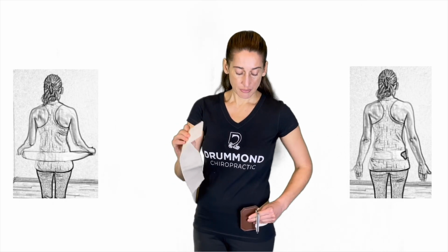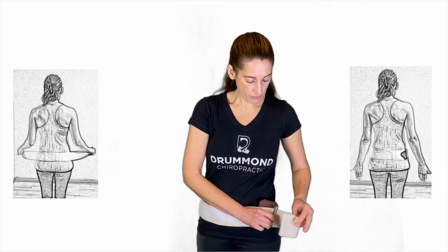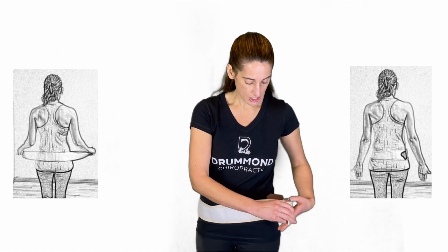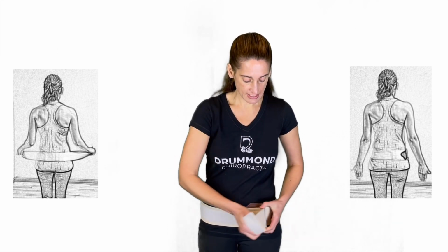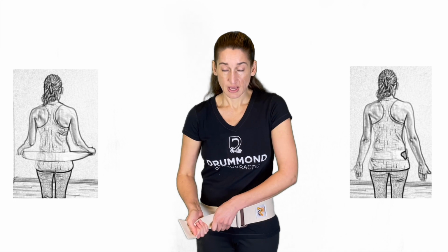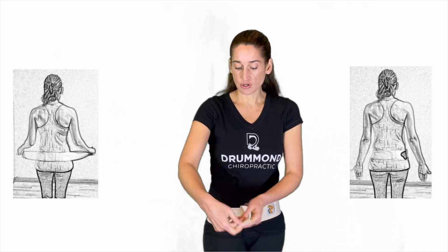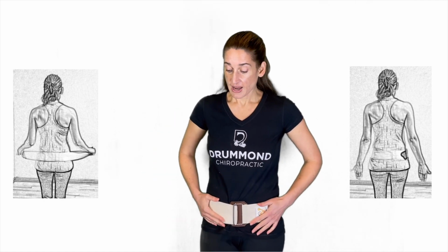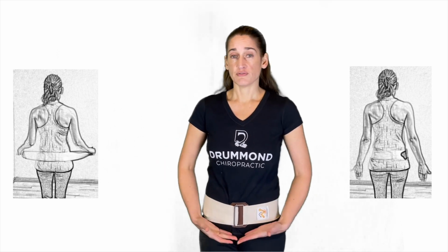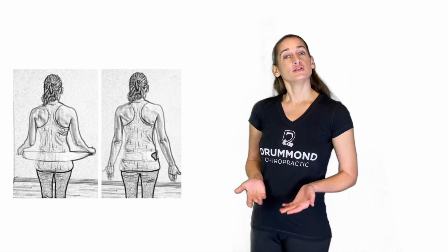You put the material underneath the white bar, and then you put it over the white bar. The bar has basically teeth on it that help hold it in place. I like starting it with the leather off to the side so that when you tighten it, it goes more to the center. Give it a really hard squeeze, give it all you have, and then you can use the Velcro to put it into place. And again, you could do this under your clothing. It doesn't interrupt my walking, so it's not going to affect my hip flexors, and it feels good to squish those bones together. So when do we use the SI belt?